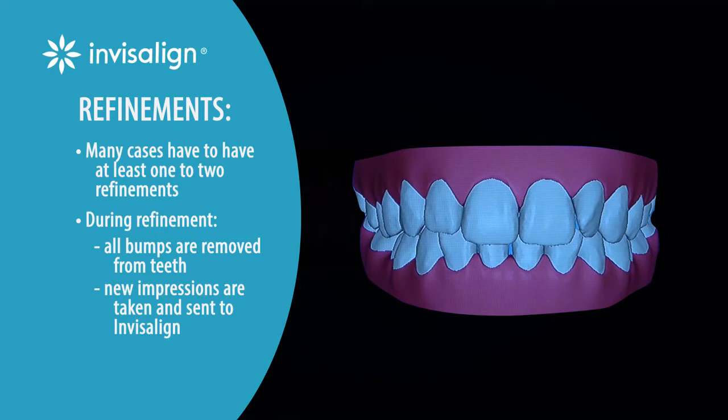Fortunately, I've had some cases that never need a refinement. They finish beautifully. But especially in severe rotations and other movements that are more difficult, things may not be together exactly the way you want them. And those cases would require a refinement.